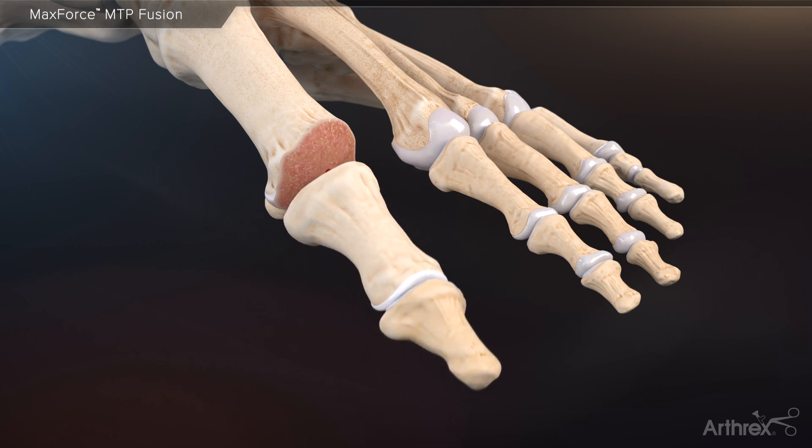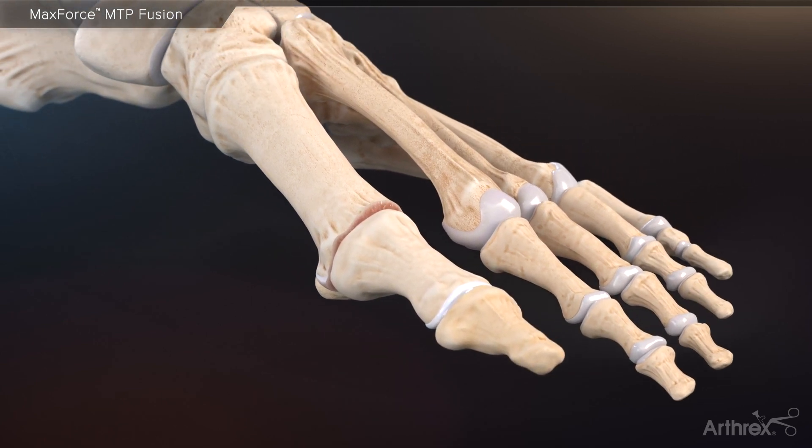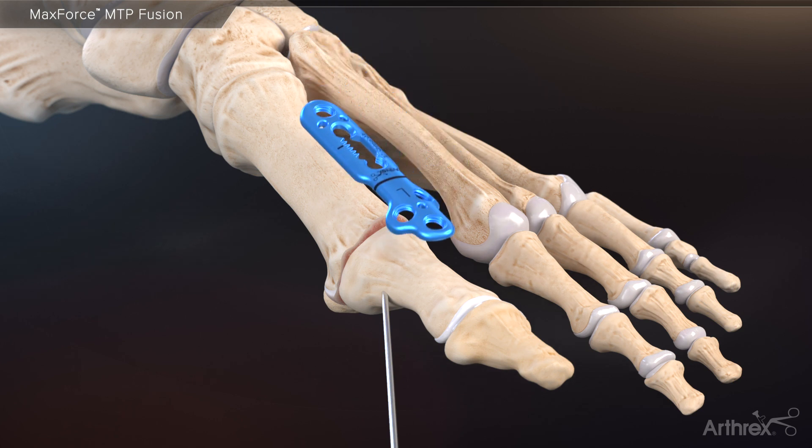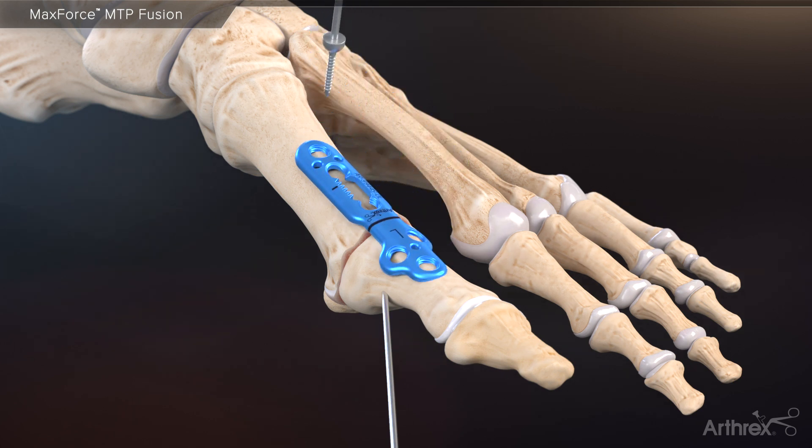Prior to provisionally fixating the plate to bone, a 1.1 millimeter K-wire for the compression FT screws should be placed across the joint to set the desired final position of the toe. While using the black line of the plate to confirm proper placement at the joint line, temporarily fixate the plate using two BB tacks.